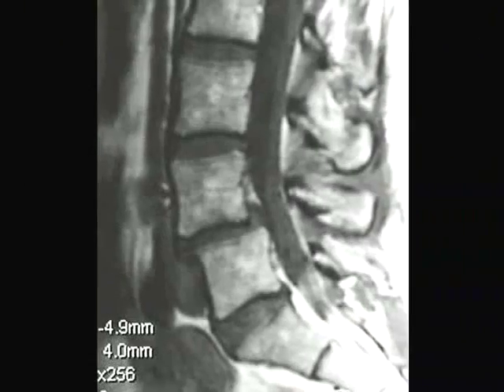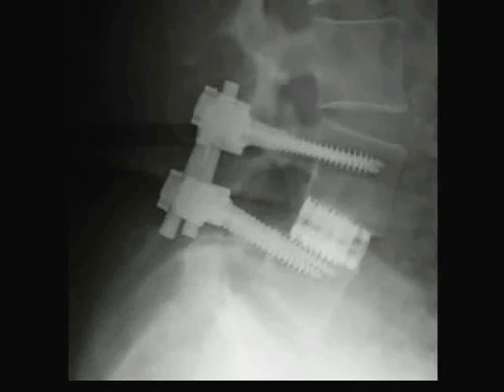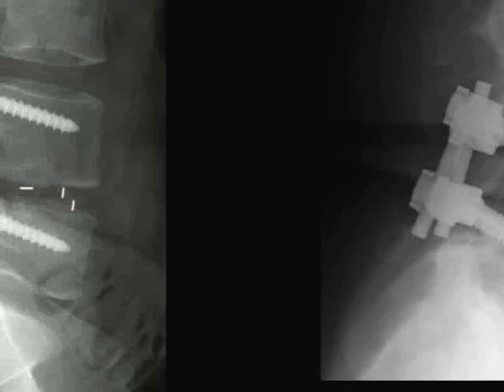This is an example of a grade 1 offset at the L4-5 level, demonstrating instability of the spine, which is a good candidate for a lumbar interbody fusion procedure. This is that same patient after he underwent a BAK interbody fusion, which is somewhat different than the type of fusion we're speaking about here, but for the same indication.